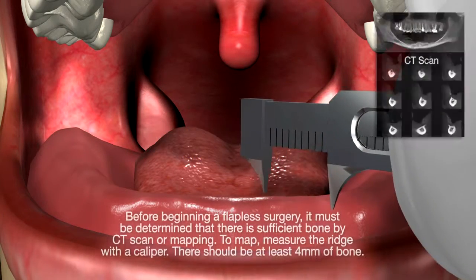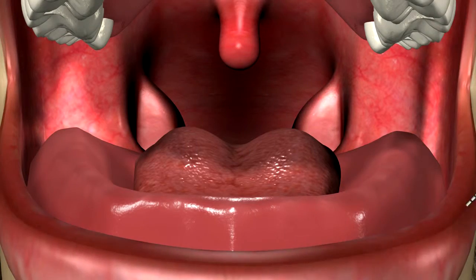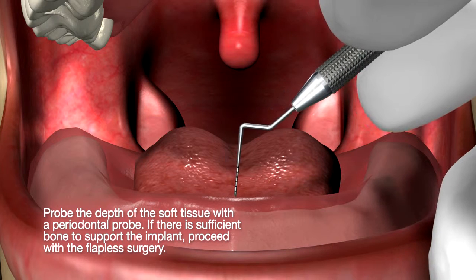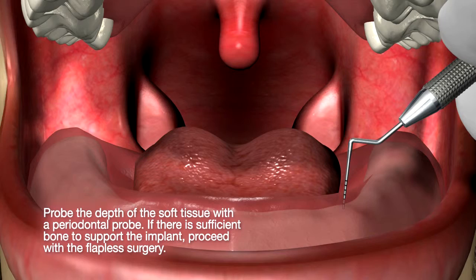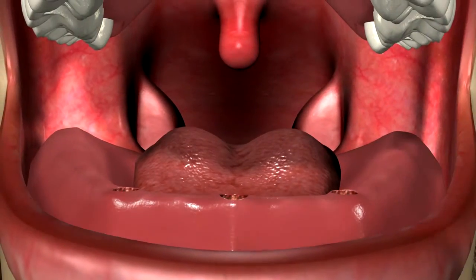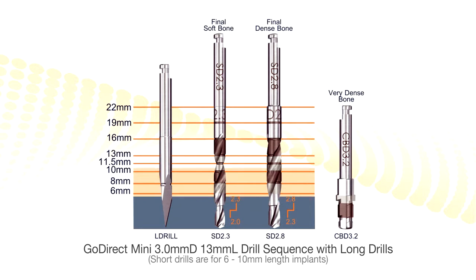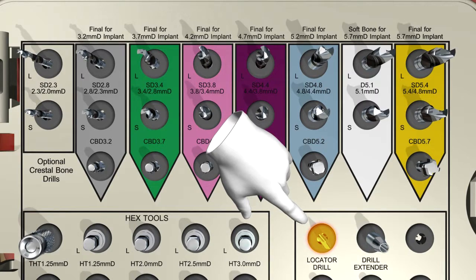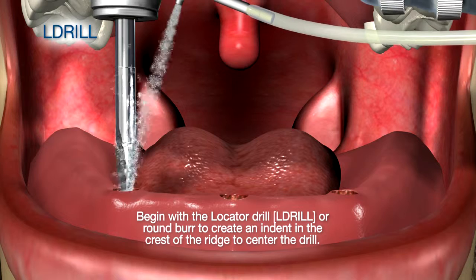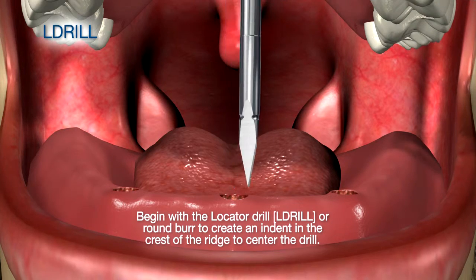Now, flapless surgery, you need to establish whether you have available bone. So you can measure the thickness of the tissue, and then you can map the bone with probes, or better yet, do a CT scan and determine whether you have available bone or not. It's a much more difficult procedure than laying a flap. Do your tissue punches. Start with a locator pointed drill. In soft bone with the pointed implant, you only penetrate half the depth of the drill. So there's your locator pointed drill. For expediency, cut all three initial pilot holes.